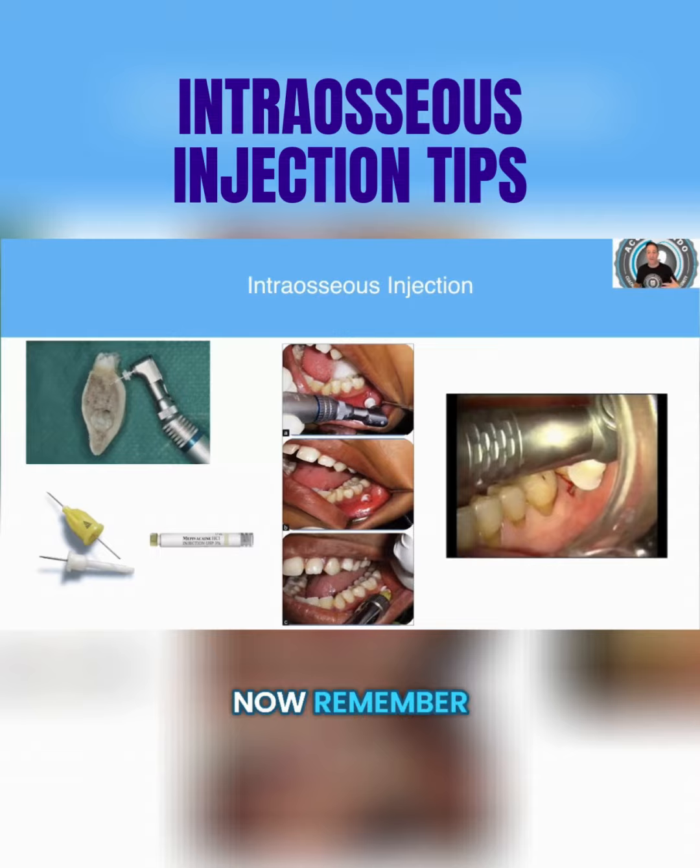Now, remember, intraosseous is a direct injection and flow of anesthesia into the medullary or cancellous bone, which is highly vascular. So if we used epinephrine in these circumstances, you could give the patient a really jarring cardiac event. So we always want to recommend and remember to use the mepivacaine. Again, this is that 3% solution without epinephrine, okay?